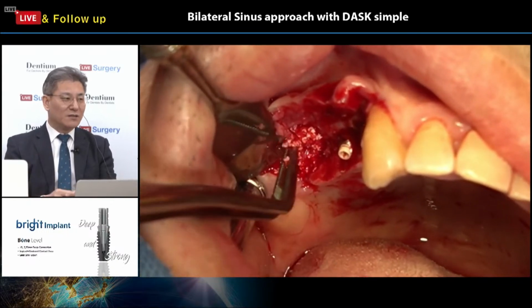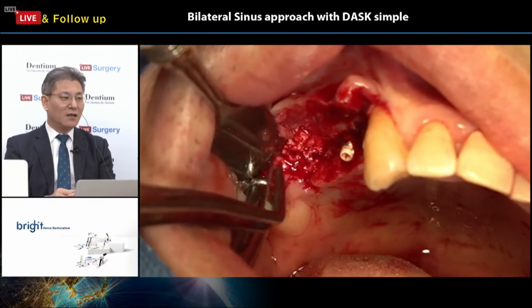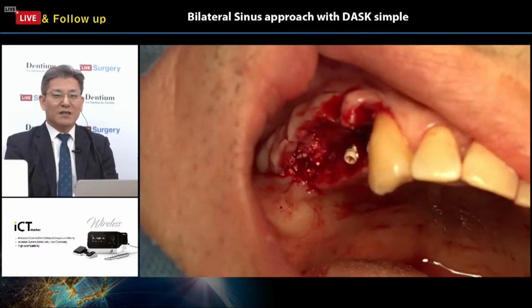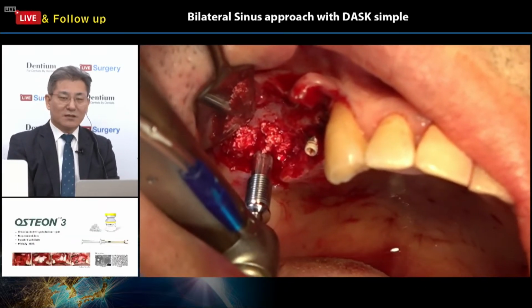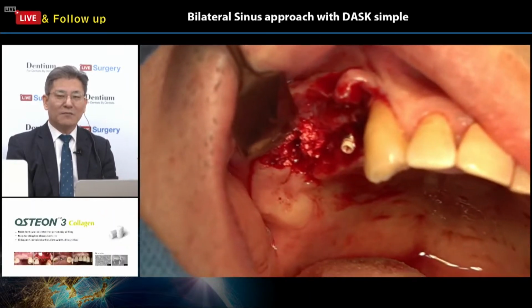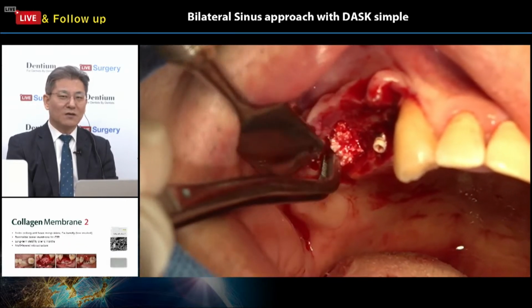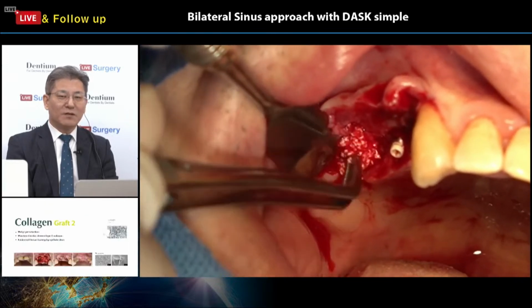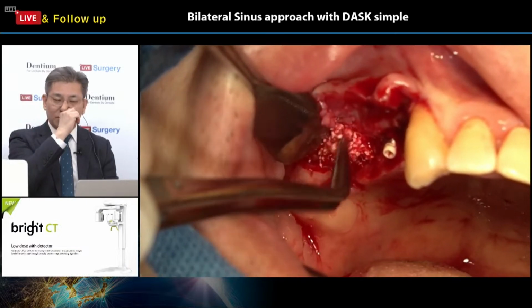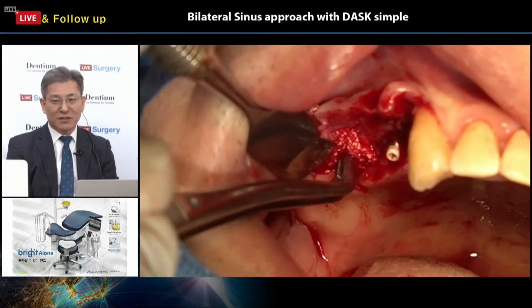Because of the development of devices like the DASK kit and hydraulic power, and there are many devices developed for the crestal approach. So very famous, big-name dentists are using the crestal approach now. It is very simple and faster. Even 2 millimeters or 3 millimeters of bone is not a contraindication for the crestal approach now.